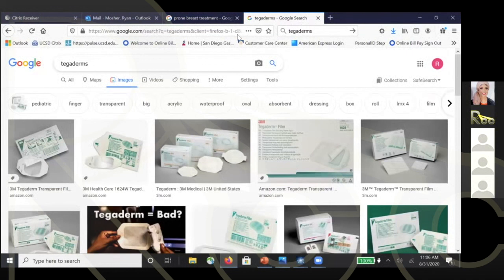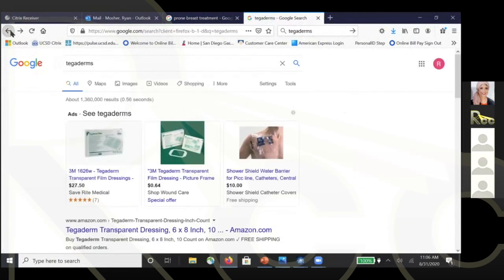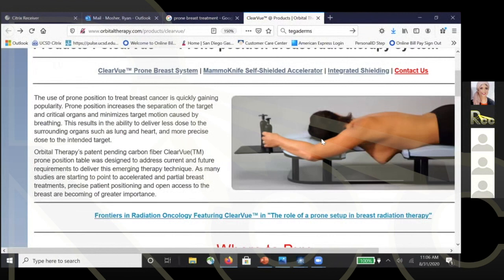That's the best way to scan a patient that has very large breasts, because then you can allow the breast to hang as much as needed, because you can't fight gravity. So you have to have a breastboard in order to treat an obese breast cancer patient.